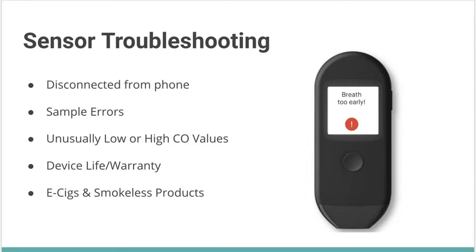However, if the user still can't get their sensor paired, please go ahead and send that to tech support. They can also get several sample errors, so they can blow too early. Instead of waiting for that third beep, they blow before that third beep. They can blow too late, so they waited beyond 5 seconds beyond that third beep.